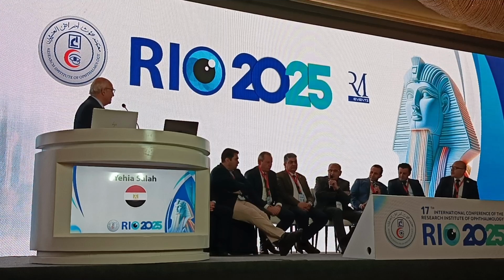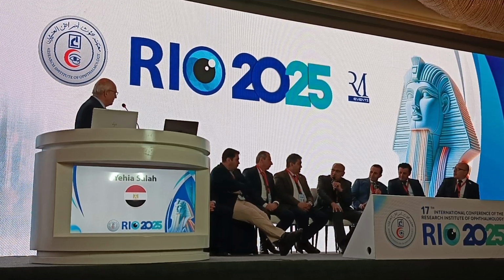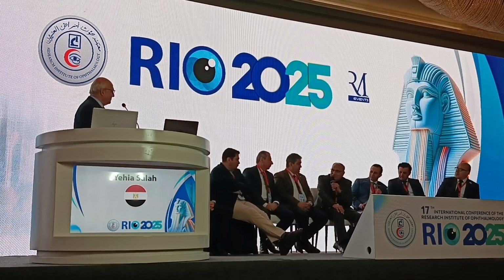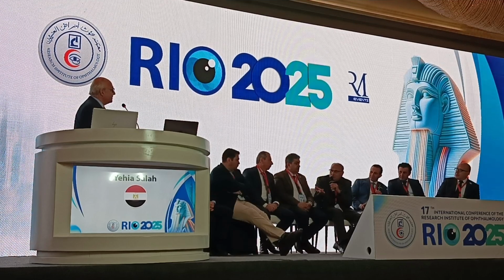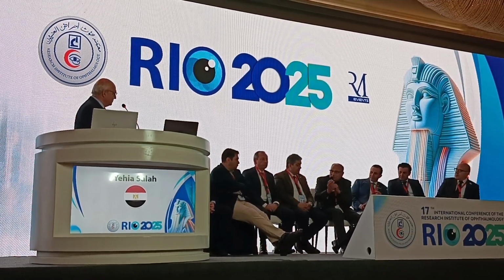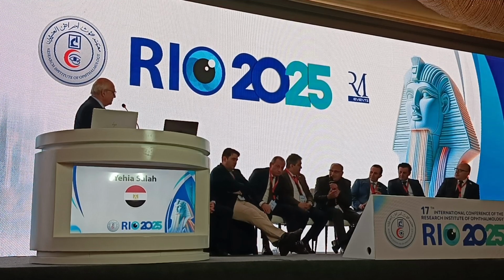She doesn't have LASIK. I'm talking about similar cases because actually I was one of the accused surgeons who did lots of this surgery in the 90s and actually regretted it. And they all came back with trouble. This was the first phakic IOL for myopia we got in the world. Yes, we all used it. And actually, they came back with problems, either corneal decompensation, iris atrophic changes, synechiae and cataracts.